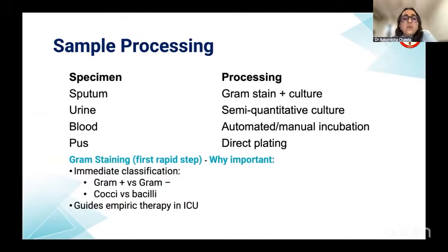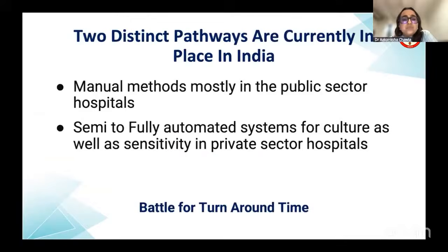Now, what is the importance of gram staining? When your microbiologist tells you that it is growing a gram positive or a gram negative bug, that actually helps you to further guide your empiric therapy in your ICU. This is very important and crucial for your critically ill patients.